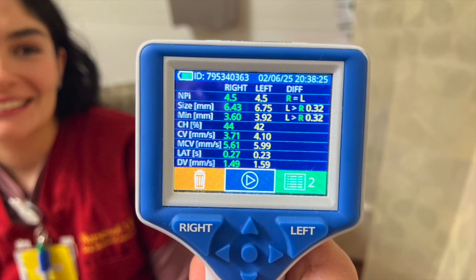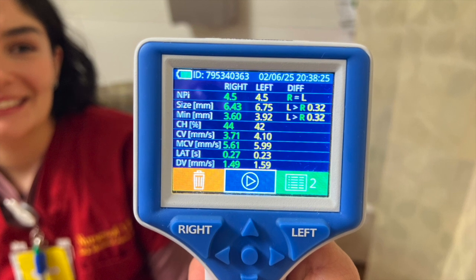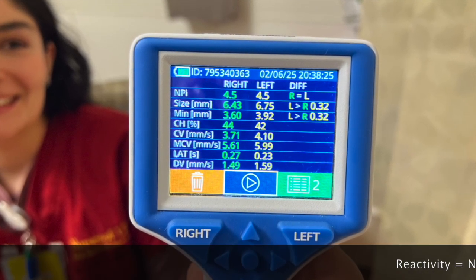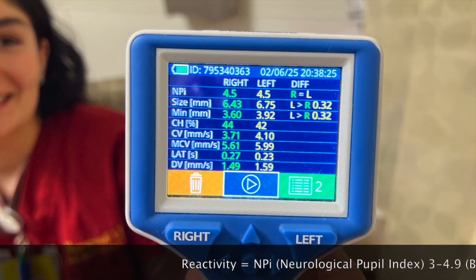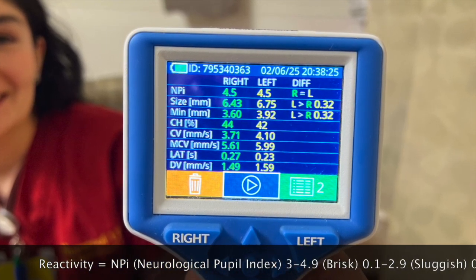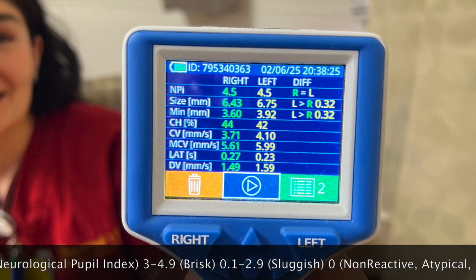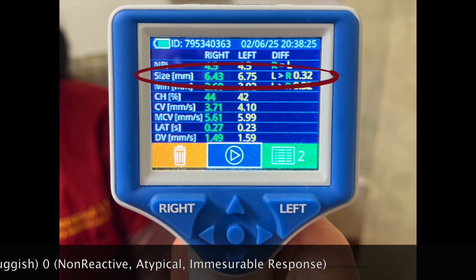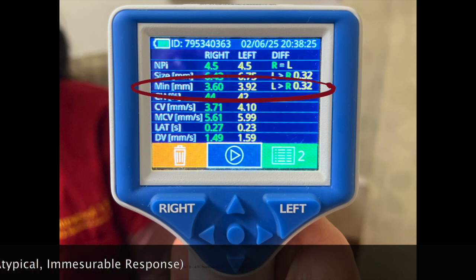After adequately using the Pupilometer, documentation will consist of the following for both eyes. Reactivity is defined by the neurological pupil index: 3 to 4.9 is normal or brisk; 0.1 to 2.9 is abnormal or sluggish; non-reactive, atypical, or immeasurable response; and pupil size and symmetry.